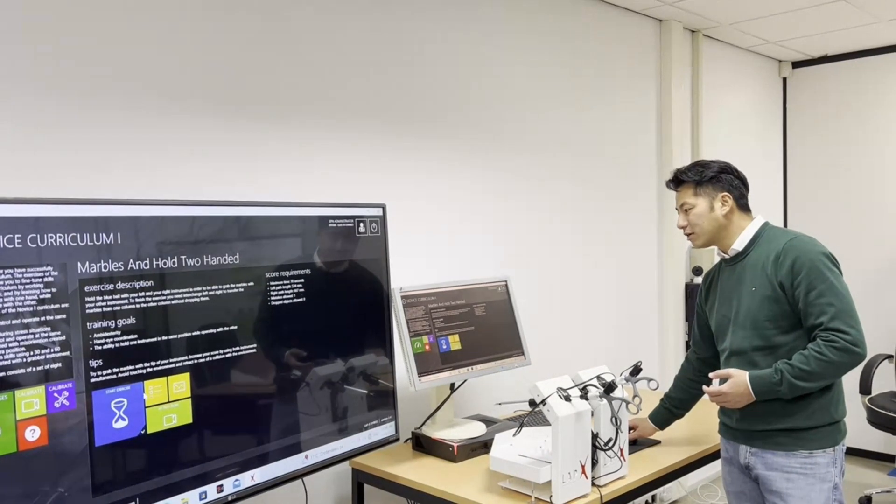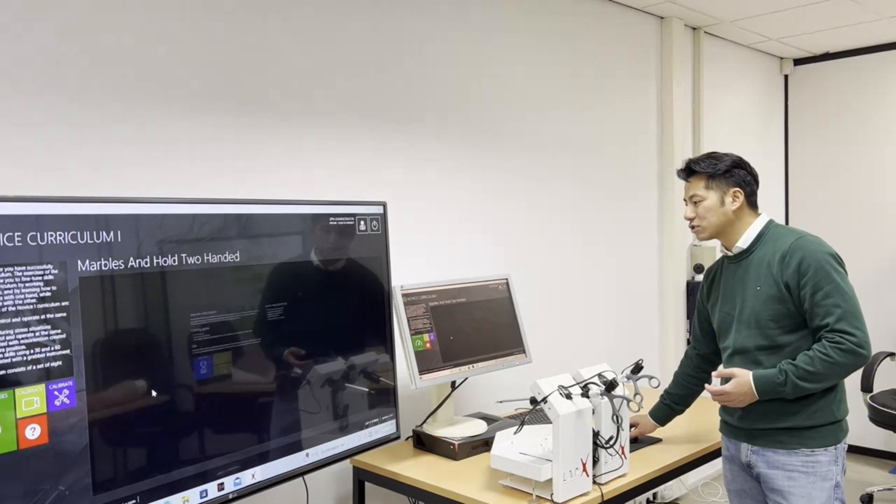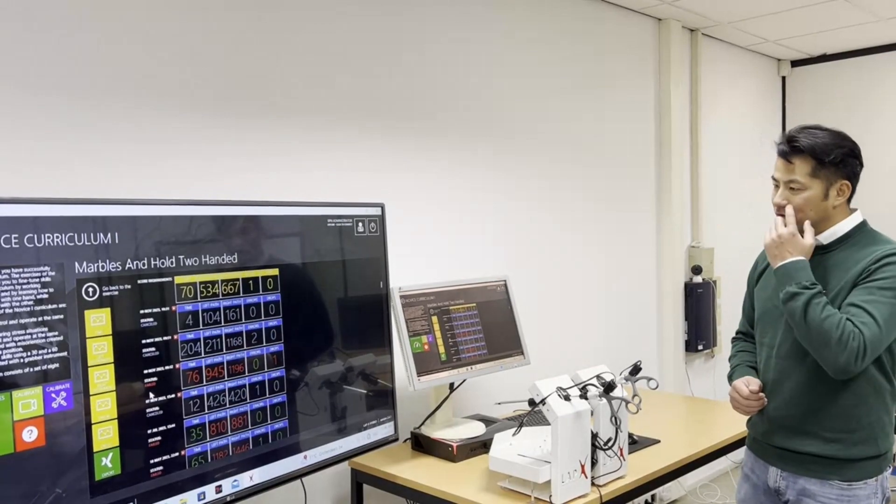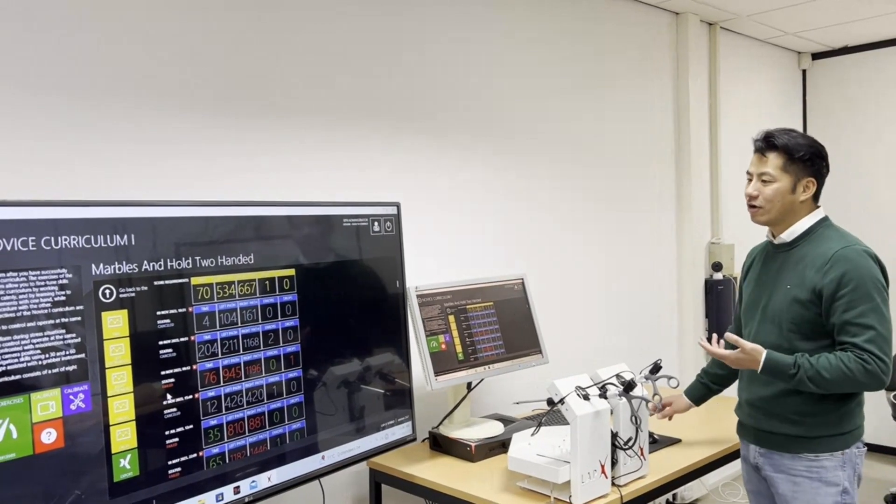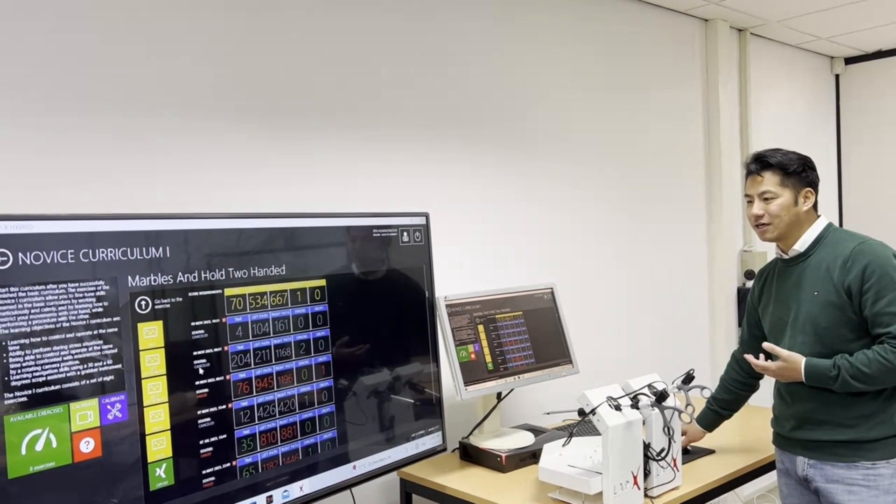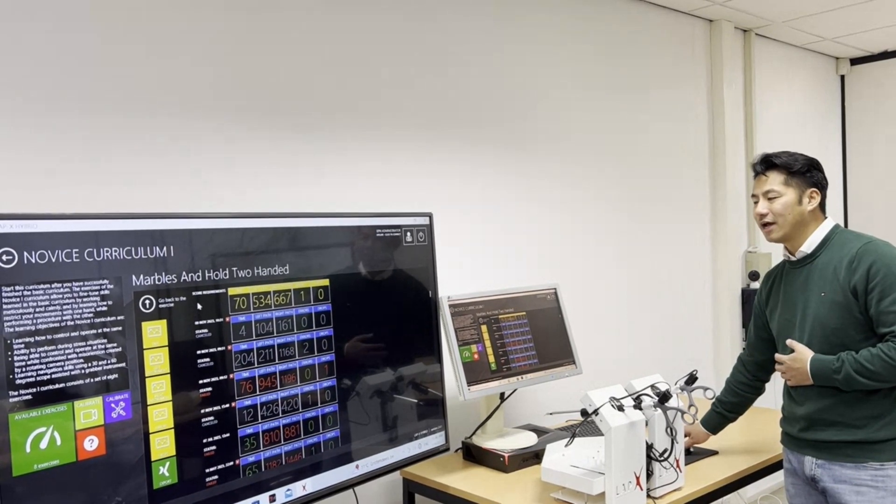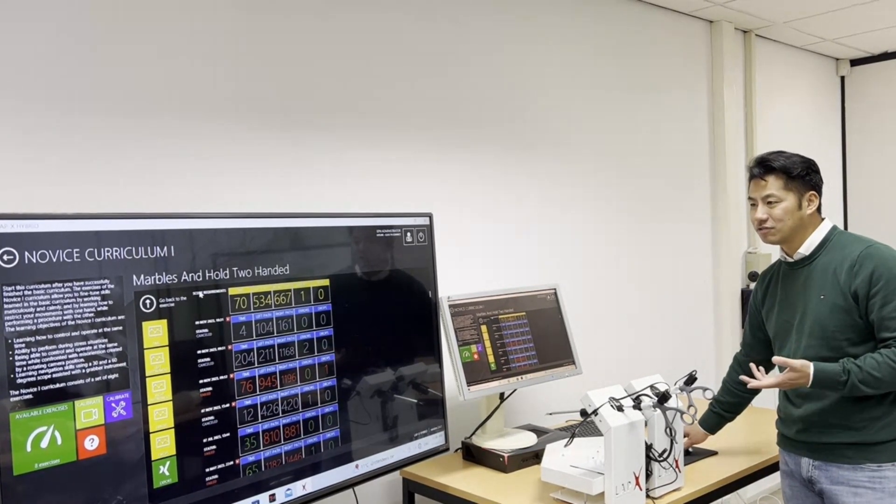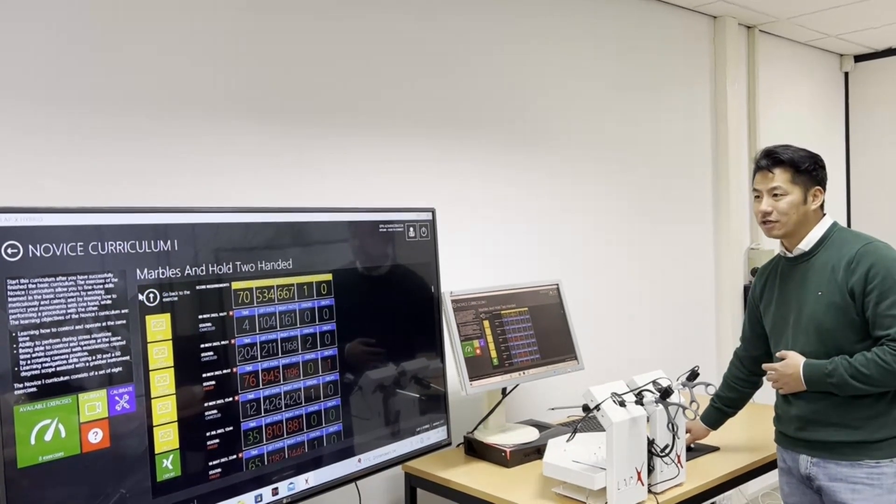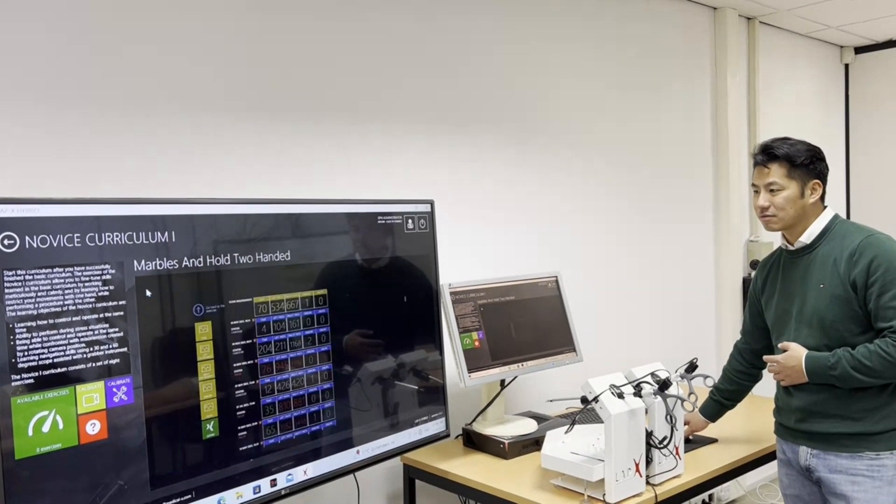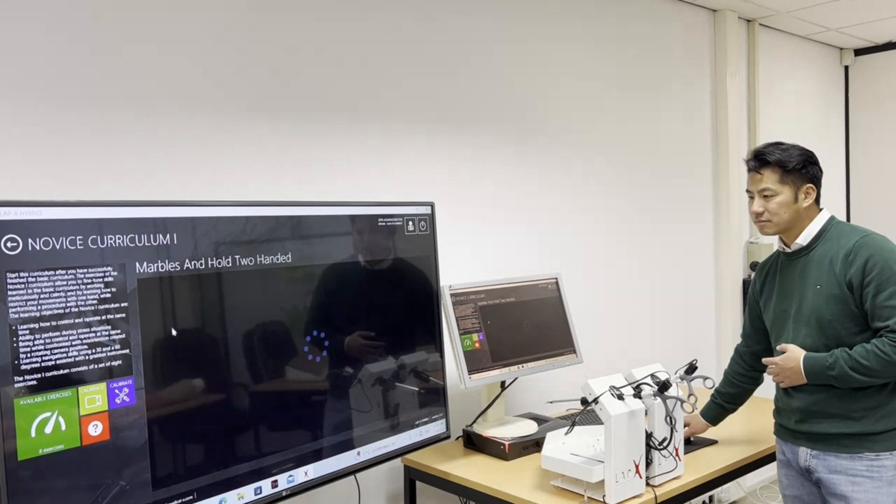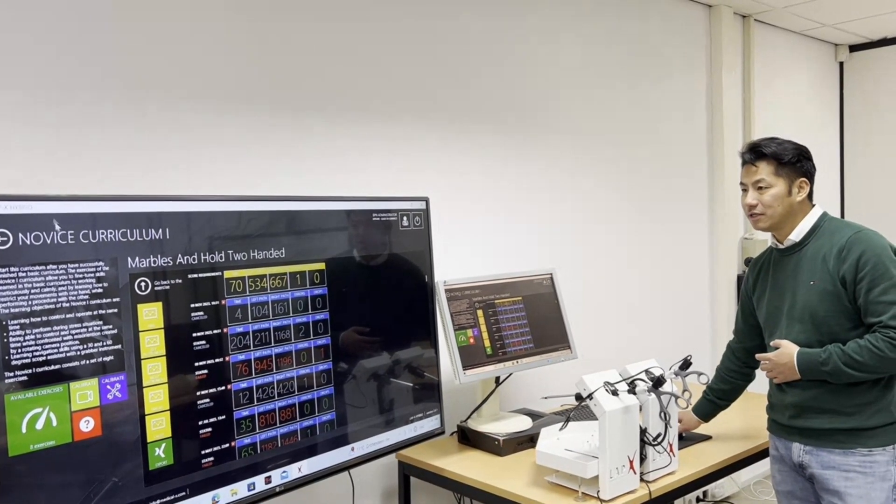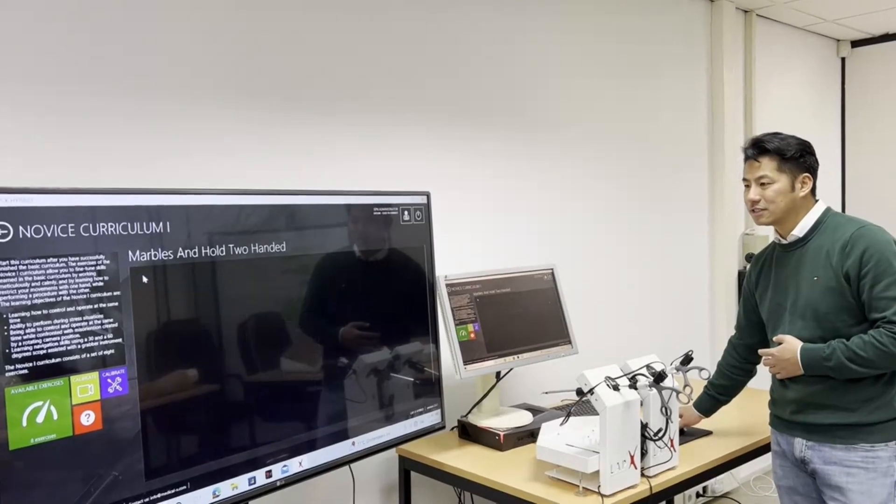And what you can also see is the scores. So as a student you can see how you have performed in the past and you can check your progress and these exercises results are also available for the teacher.